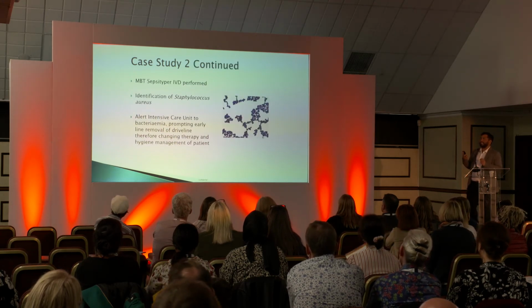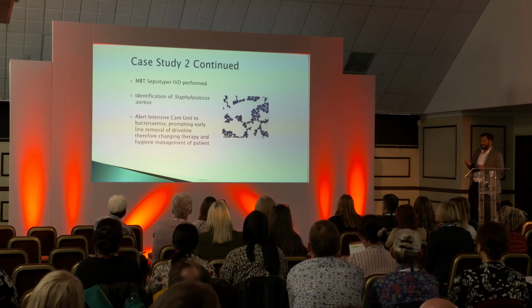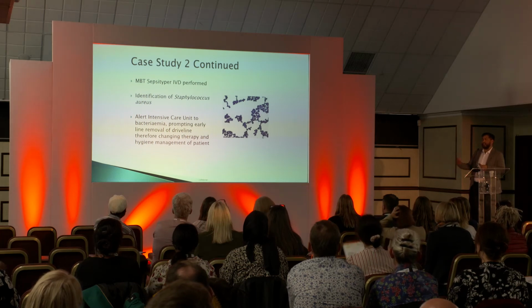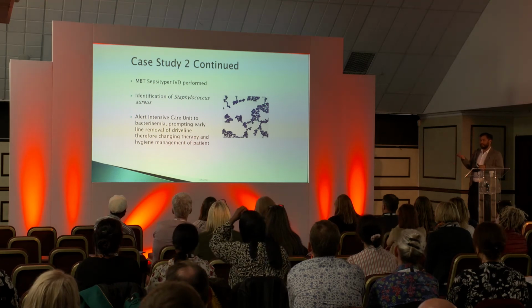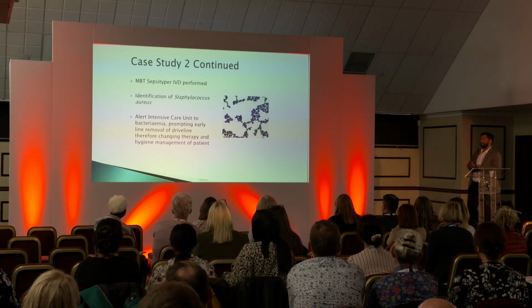Now, when we used the Sepsityper, after it flagged up positive, they actually had a Staphylococcus aureus. And this, again, changed the management for the patient. We got the result and phoned it straight to the intensive care unit to let them know: bacteremia, prompting early line removal of the driveline, therefore changing therapy and hygiene management of the patient.